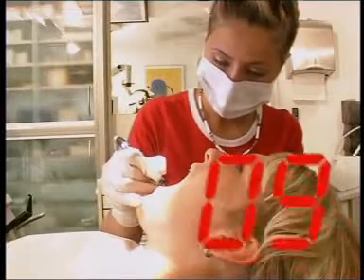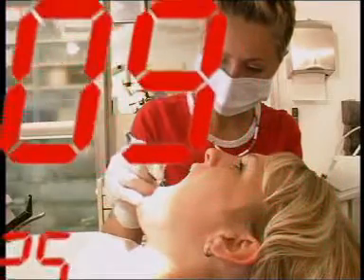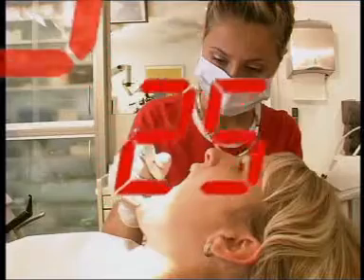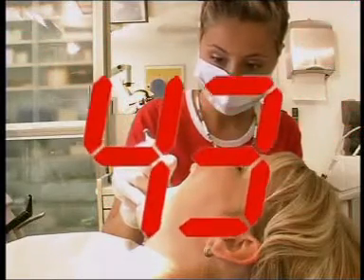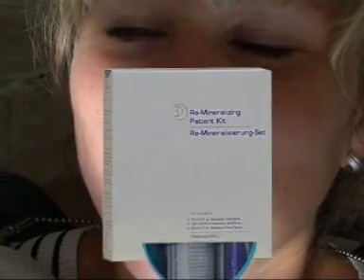After four to six weeks of remineralization, the new reference value may be lower than, equal to, or even greater than the initial value. During remineralization, food-based chemical processes can cause harmless fluorescent stains or colorings to lodge within the still porous structures, leading to an increase in levels measured.